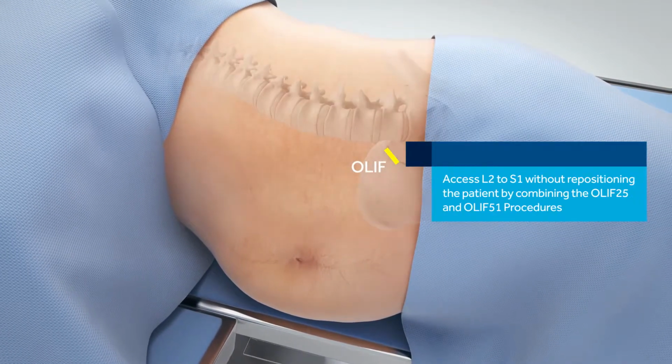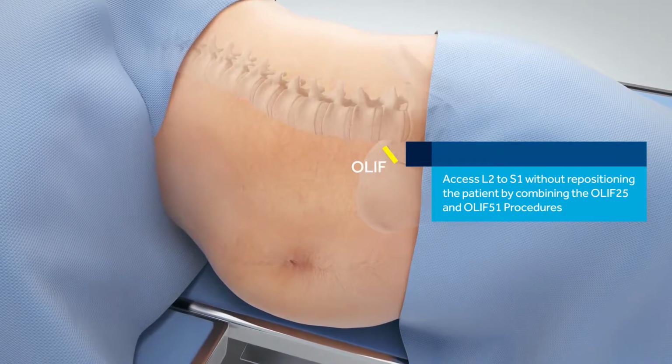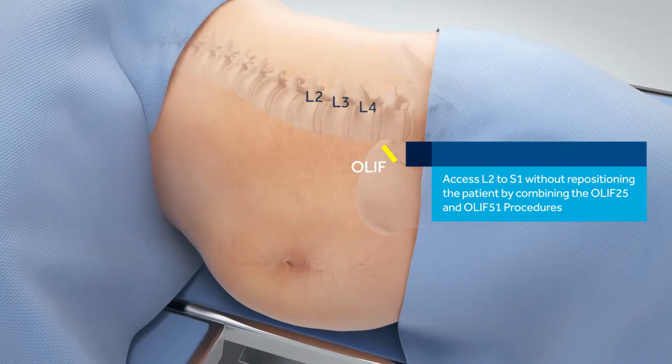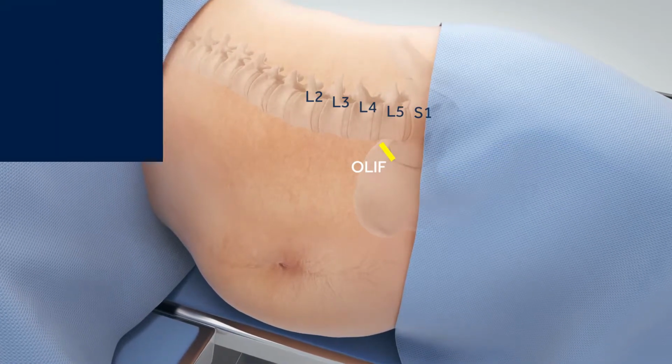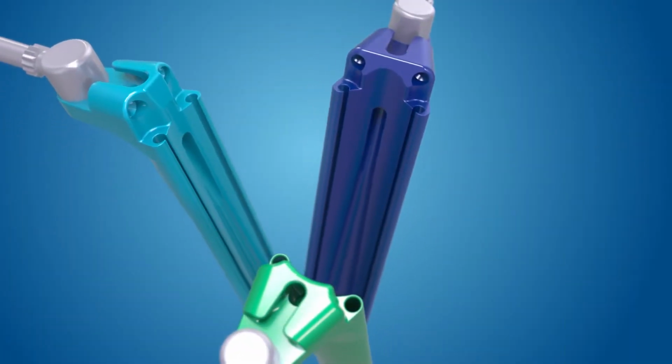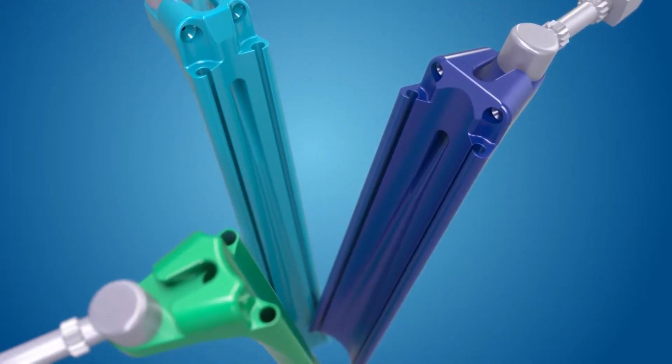In combination with the OLIF25 procedure, OLIF51 allows a surgeon to access levels from L2 to S1 with the patient in the lateral decubitus position. The OLIF51 access system is a retractor system optimized for the OLIF51 procedure.